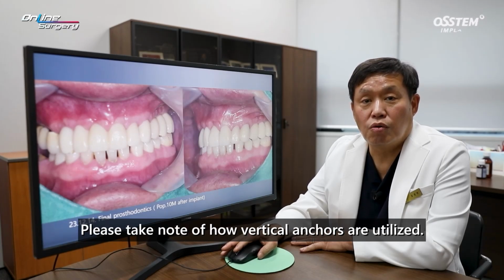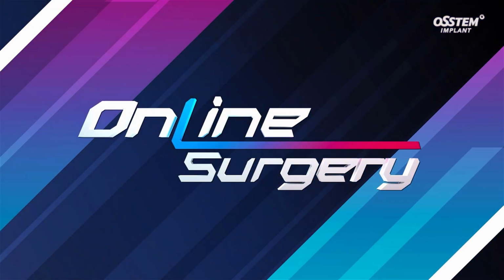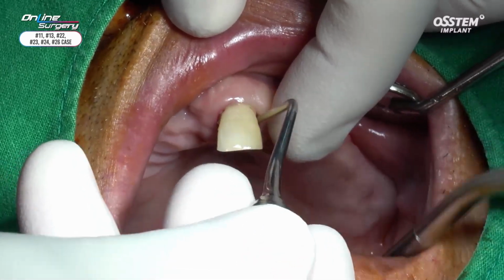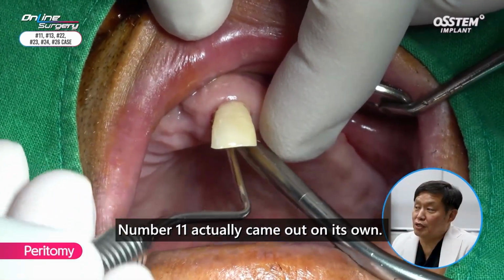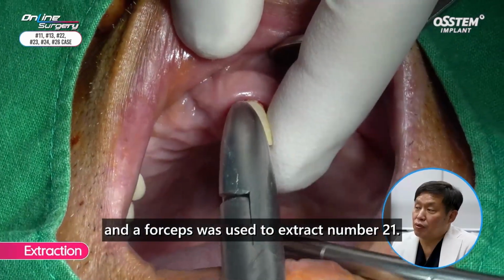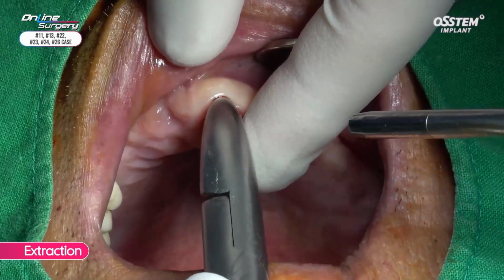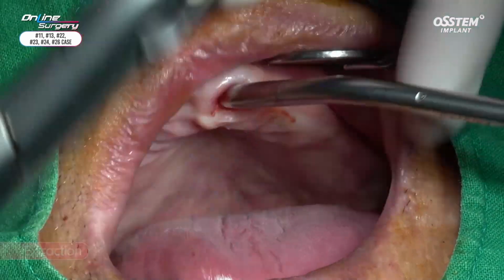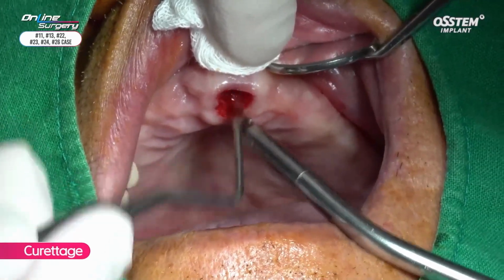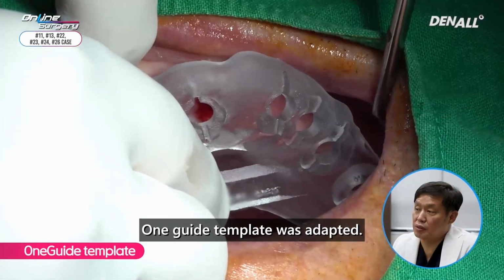Please take note of how vertical anchors are utilized. Number 11 actually came out on its own. Peritomy was performed, and forceps was used to extract number 21. OneGuide template was adapted.